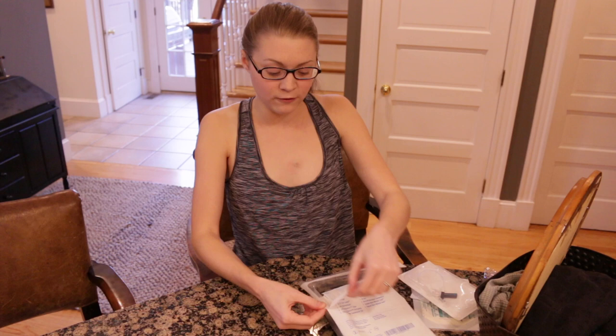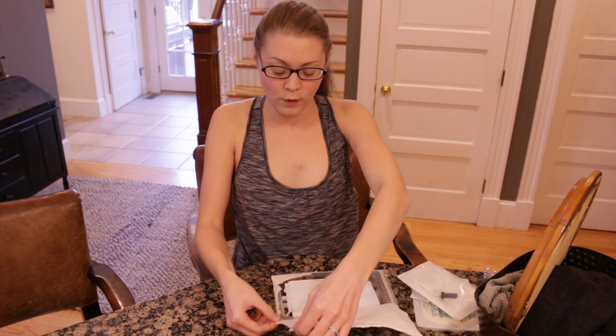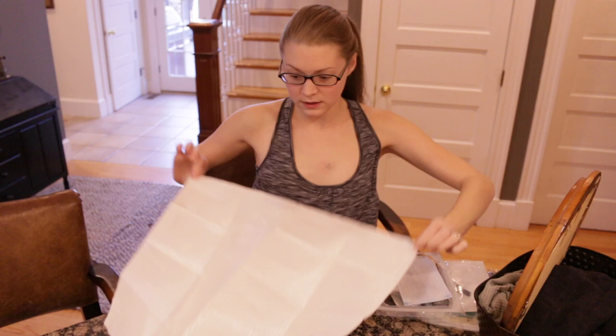We start by opening up our dressing change kit. You want to be careful not to touch anything inside — I'm only touching the rim. The most important thing to remember when you are accessing a port, whether you're doing it or somebody else is: keep it sterile. When I pull out the sterile field, I take it out by the edge and make sure I don't touch the middle at all because I'm not sterile yet. I've got my sterile field — I've only touched the edges, so I'm good to go.